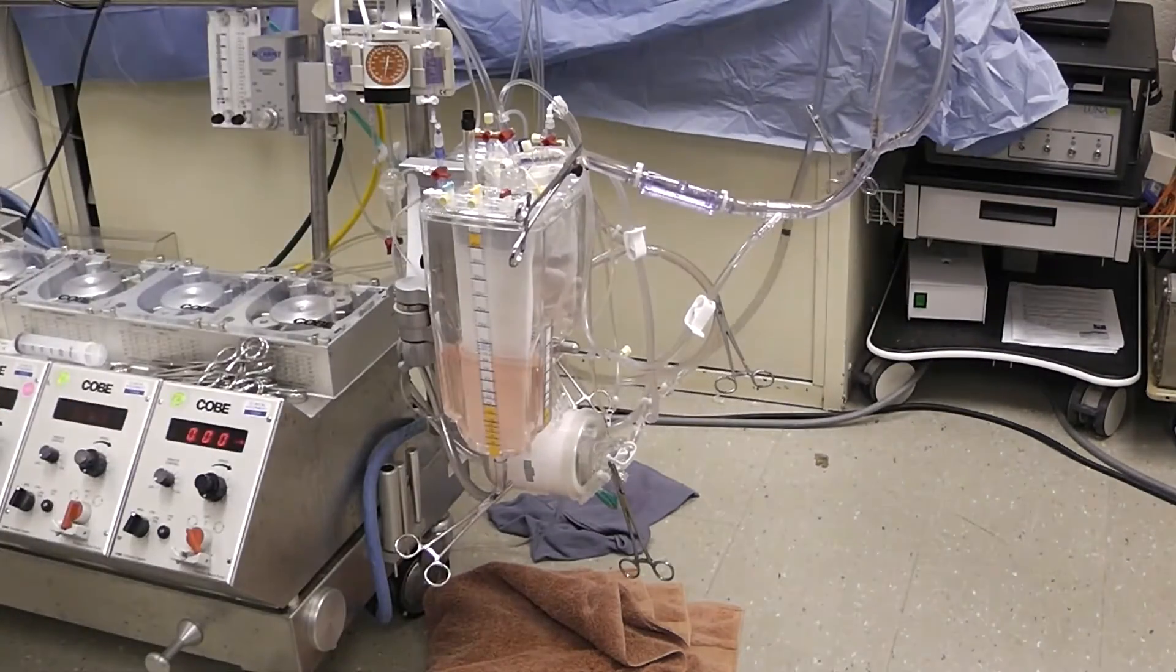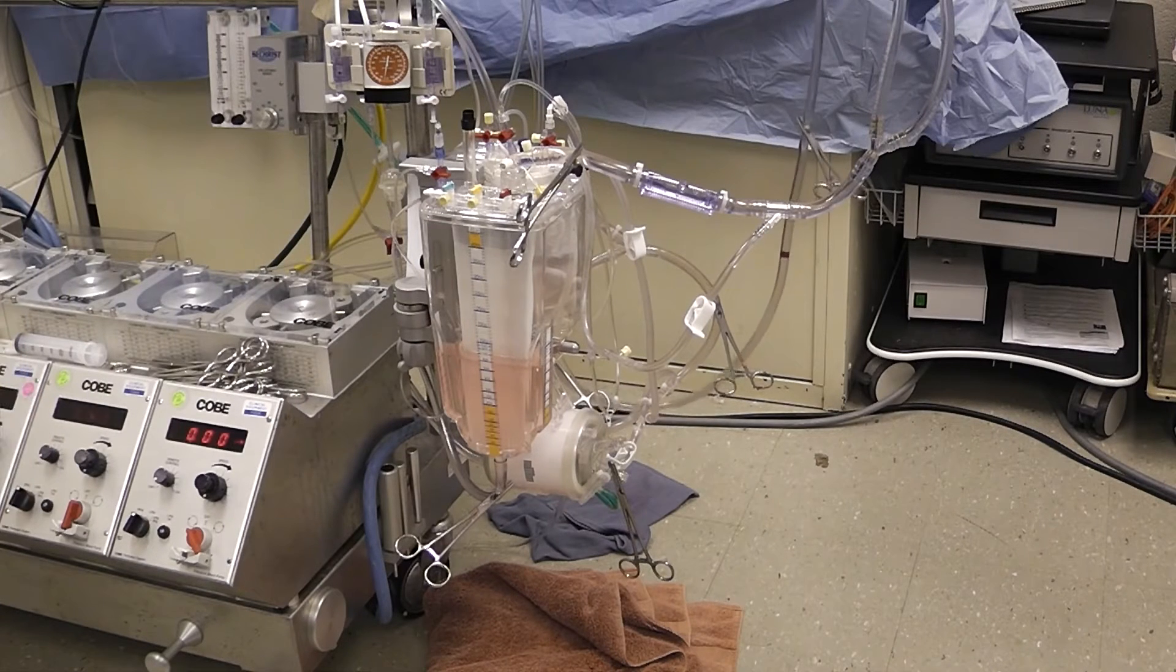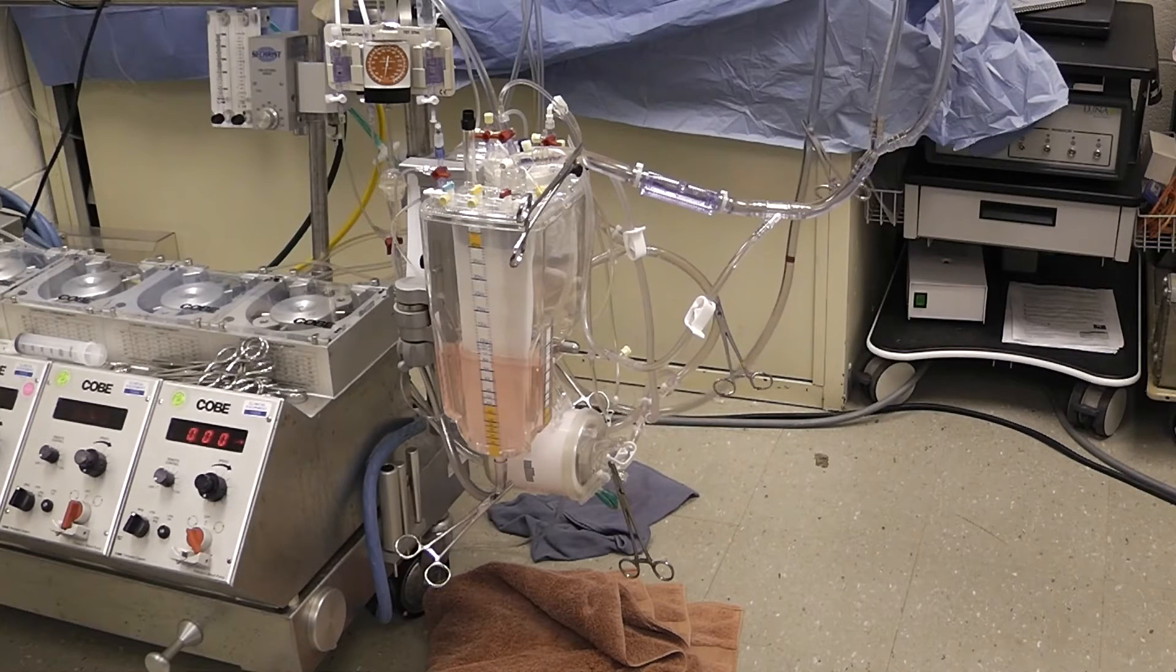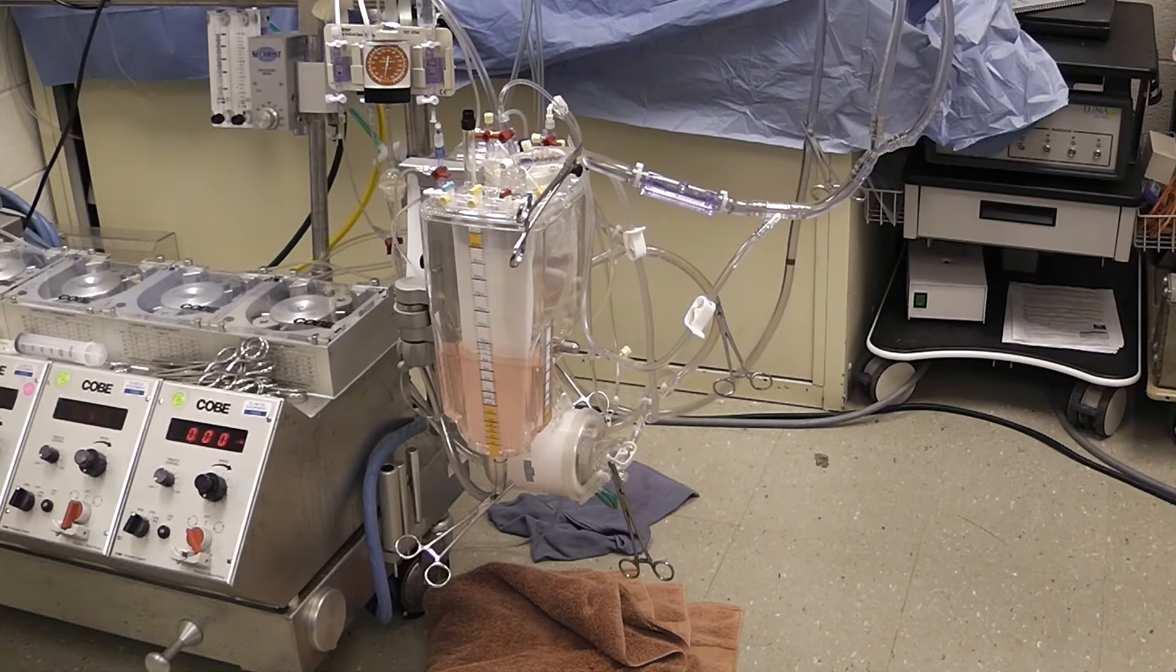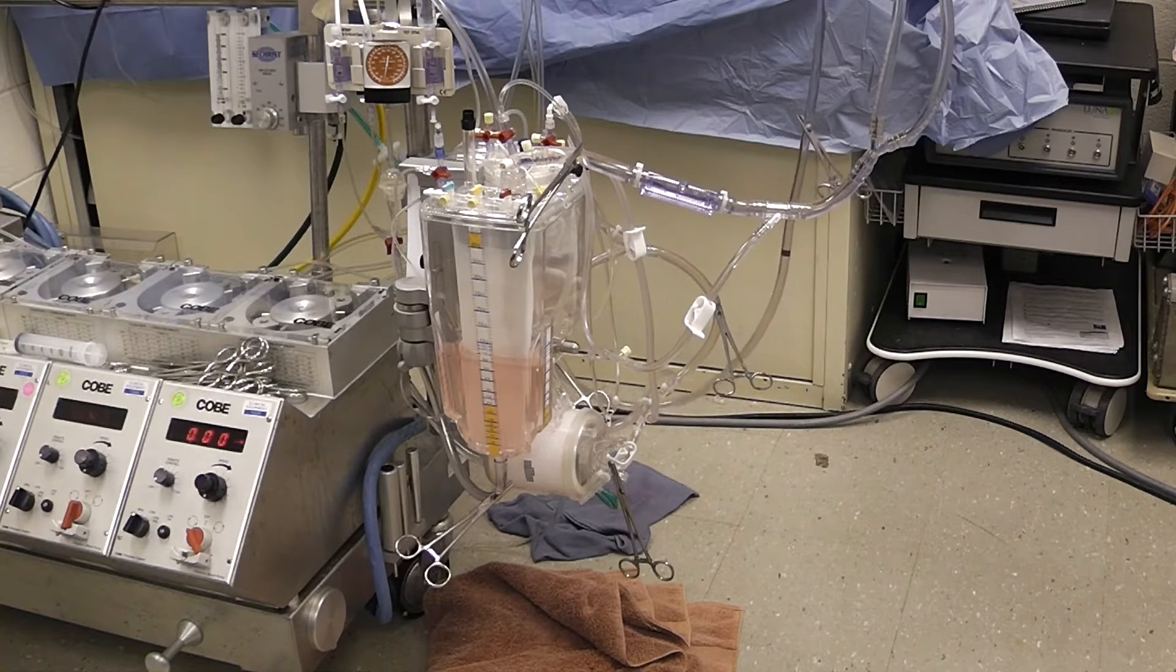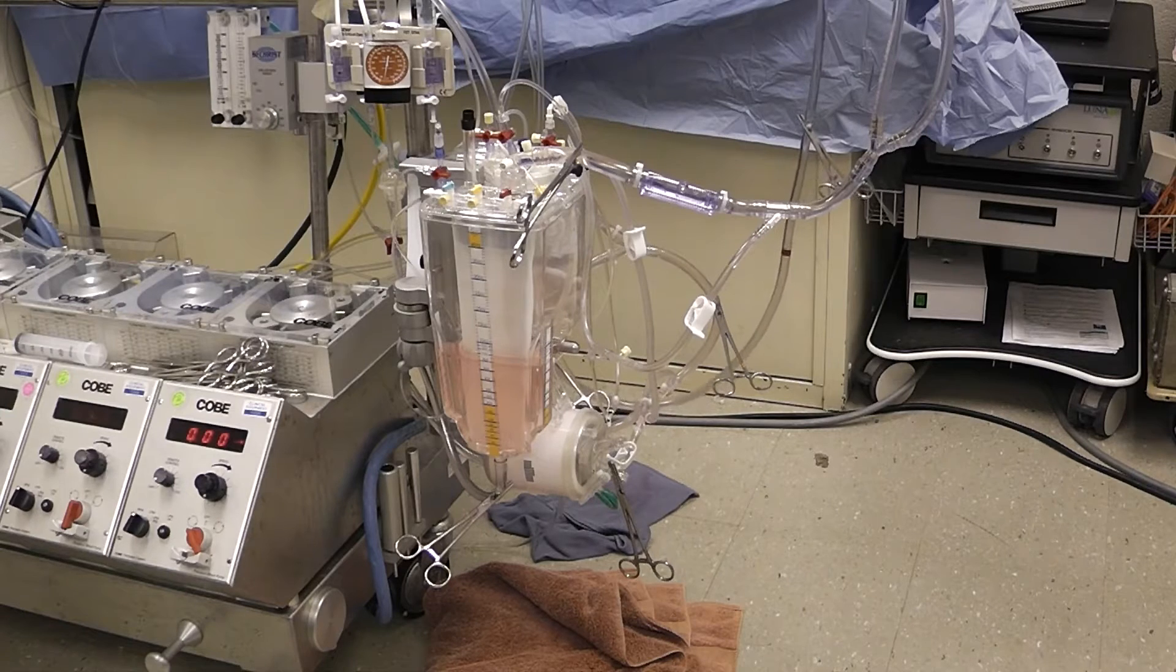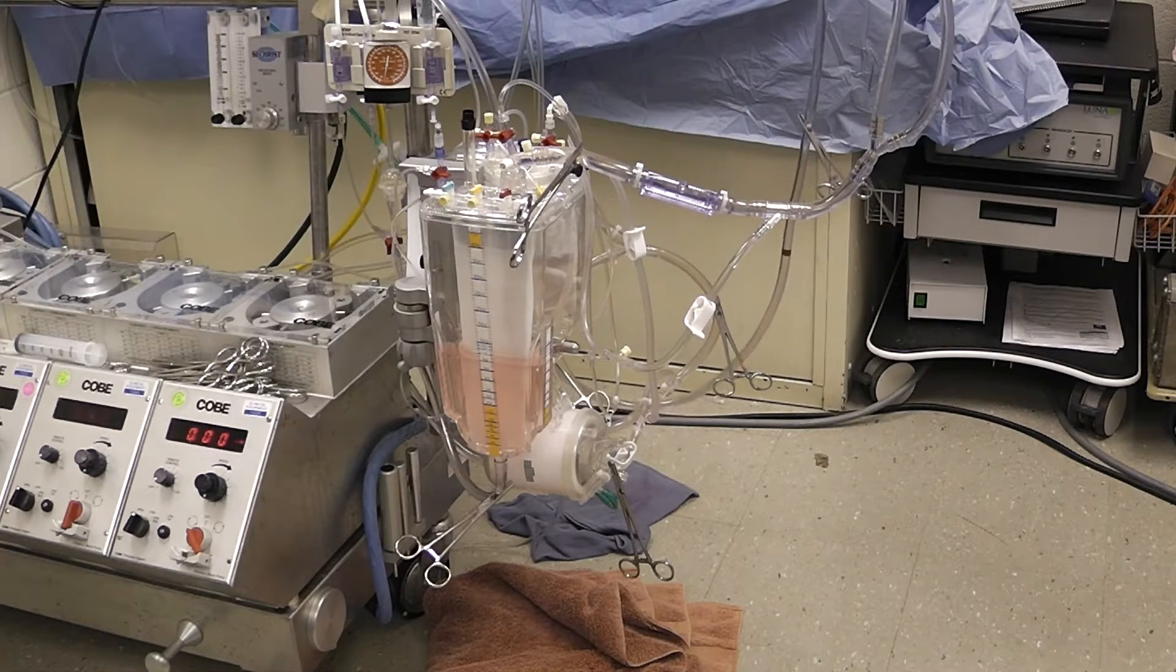We also need to let the surgeon and anesthesiologist know what has occurred and have someone run to the pump room and get us a new pump head. We're also going to need some connectors. We happen to use three-eighths inch line, so we're gonna need two three-eighths to three-eighths inch connectors. We'll also need some alcohol or betadine swabs, a sterile scissors or scalpel, and we'll want some gun ties and a gun as well.